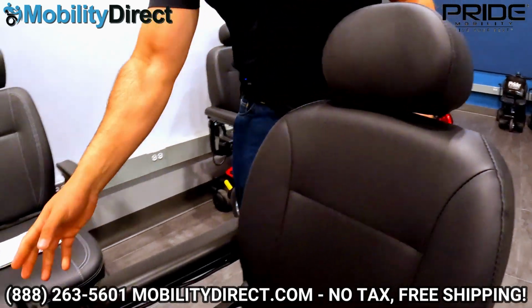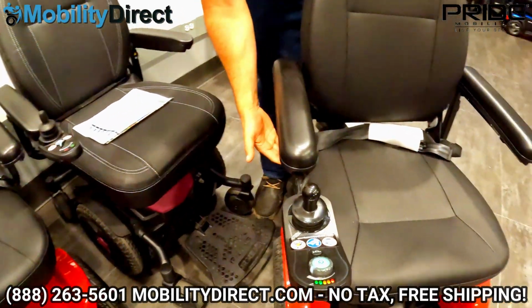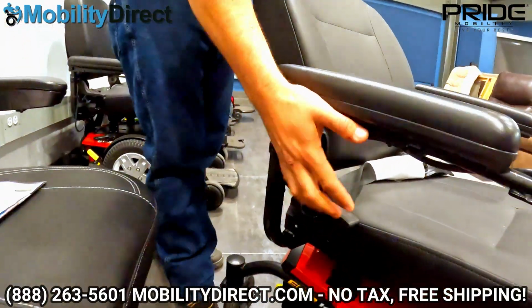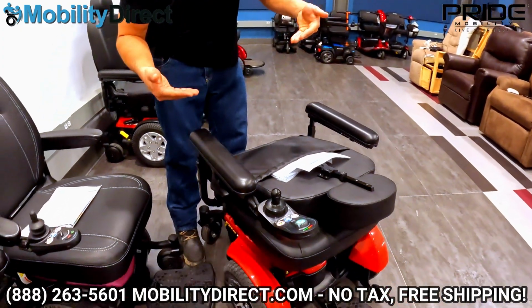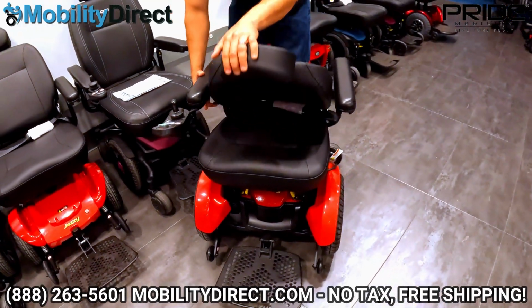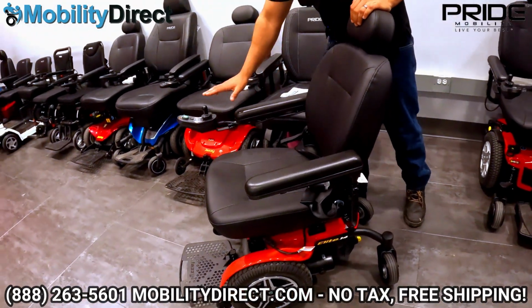Now on the right hand side, there is a lever to do a semi-recline. It goes far back, not all the way, and you can use that lever to fold the seat all the way down, and that helps when you're removing the seat. The seat's pretty heavy, so you might need 2 people to do that, but there are no tools required. Just pick straight up. And let's work our way to the joystick here.